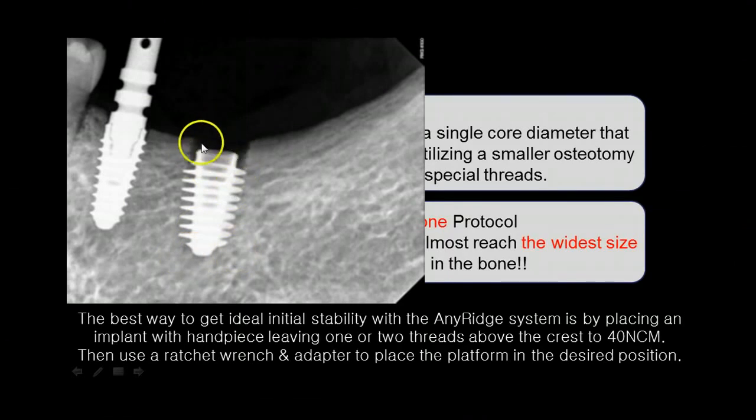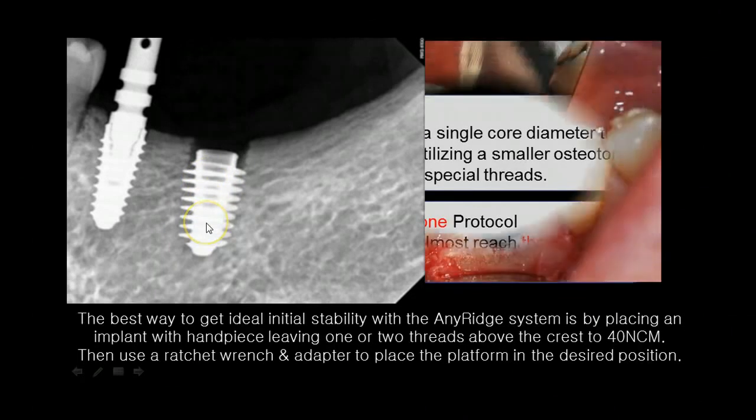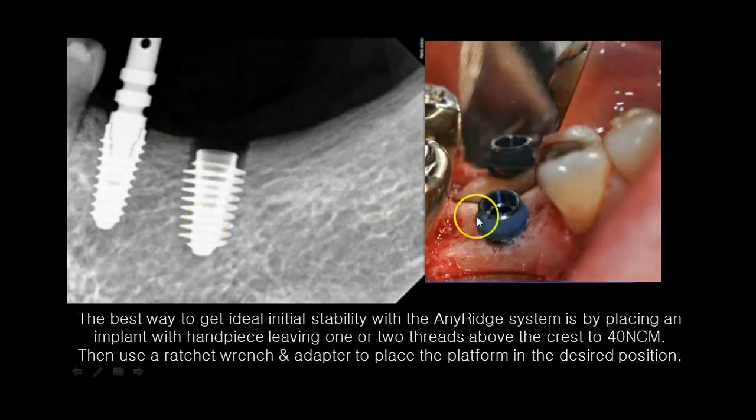Again, relative to the bone and how much resistance he was getting because of the cortical bone, he basically made room for your implant to go in without getting stuck. And you'll see what I'm talking about in just a second. But that's still preserving crestal bone.